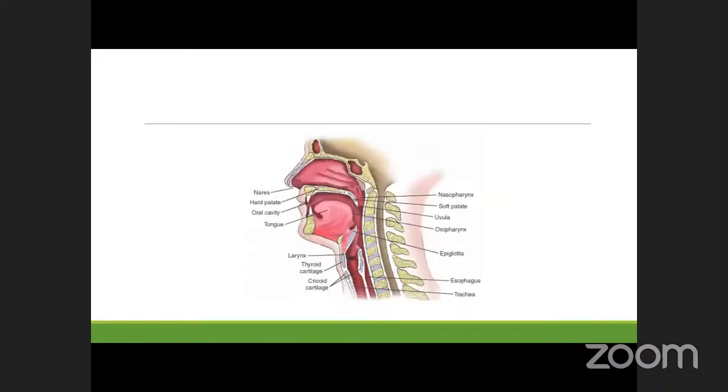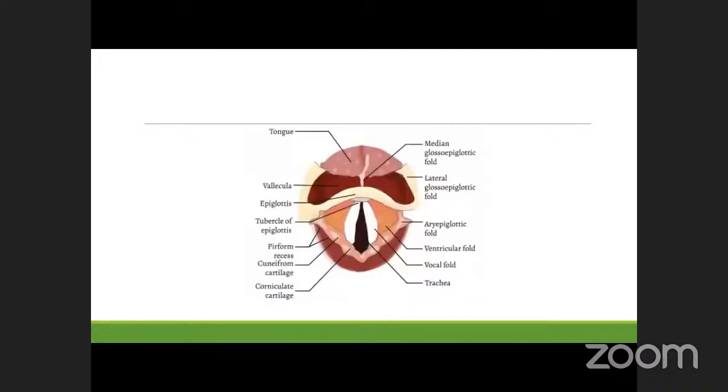But what do those devices have in common? For the most part, it's all about anatomy, all about where they insert. Can anyone here tell me where LMAs usually stop? So the SGAs or LMAs, they usually stop at that upper portion of the airway. And the anatomical cutoff is the larynx. And so there would be a picture of the larynx.